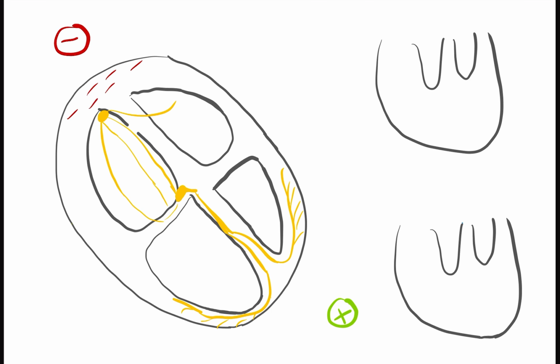So when we have the potential generated here, it's going to be positive inside the cells, but we are measuring what's outside, so we are going to measure the negative. I'm always going to draw here what's outside. We also have the electrodes here again. So now we still have this part not depolarized yet, so we can measure plus outside of the cells. As I said, outside, it's important to know that.